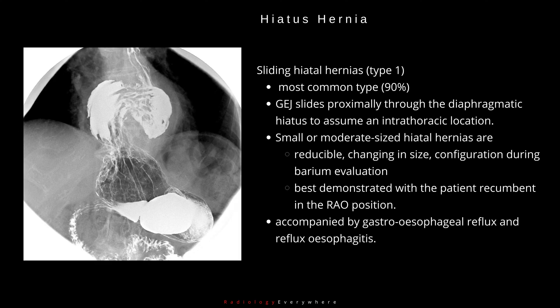Sliding hiatal hernias are the most common type, approximately 90%, and this is Type 1. The gastroesophageal junction slides proximally through the diaphragmatic hiatus and becomes an intrathoracic location. Small or moderate-sized hiatal hernias are often reducible, changing in size and configuration during barium evaluation, and are best demonstrated with the patient recumbent in the right anterior oblique position.